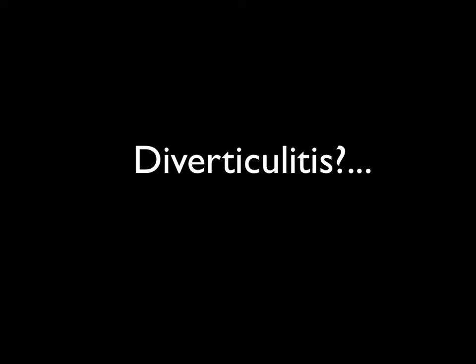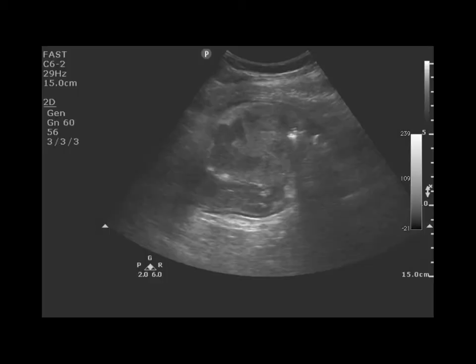identify alternate bowel pathology. This patient identified pain in the left lower quadrant, and when the probe was placed in the abdomen in this location, this is what they saw. So normally when we ultrasound the abdomen, we see a lot of dirty shadows from air-filled loops of small bowel. It may be necessary to apply gentle compression to move the bowel away from the underlying colon.